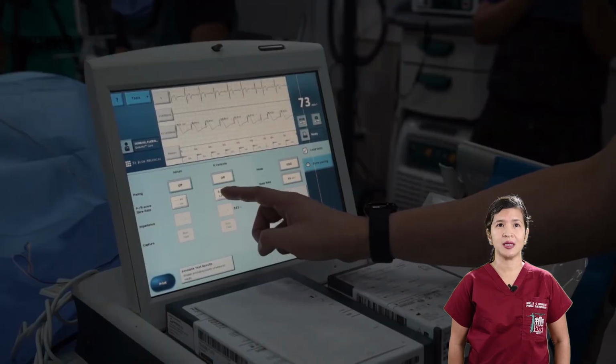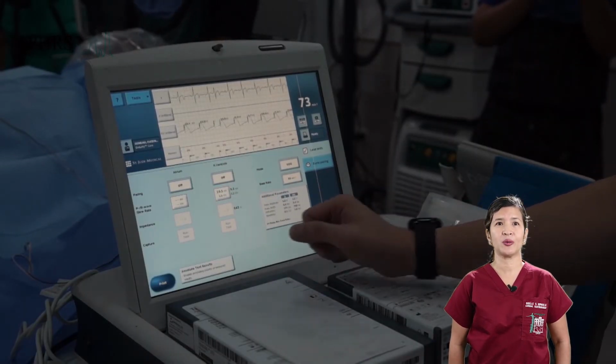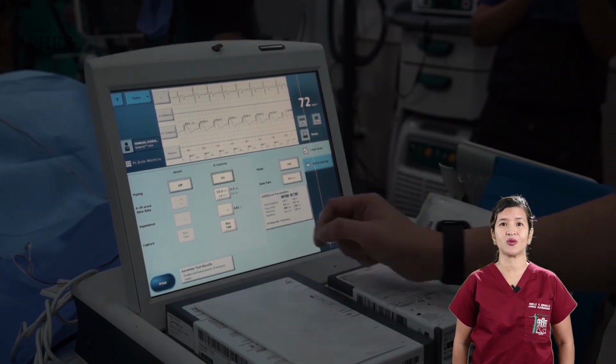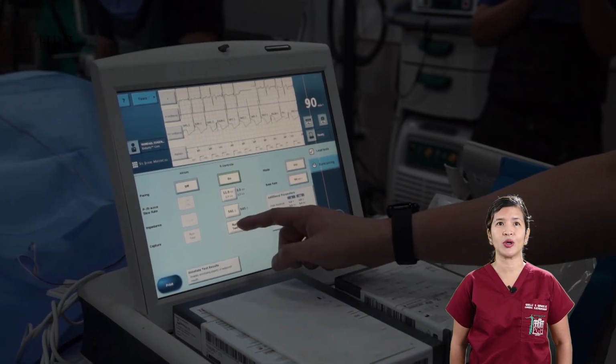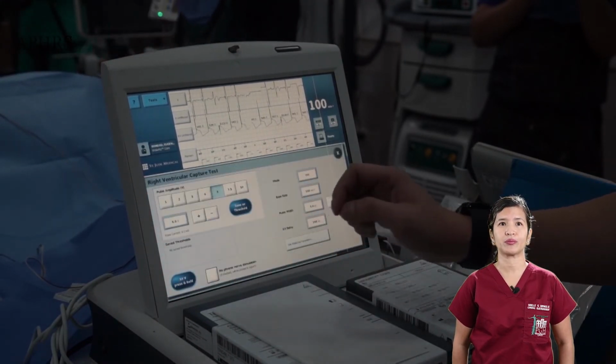RV lead testing is conducted in 3 parts. The first is the measurement of the R wave in millivolts. A minimum of 5 millivolts is required, although 10 millivolts would be excellent. The presence of an injury pattern denotes good contact between the screw and myocardial tissue.